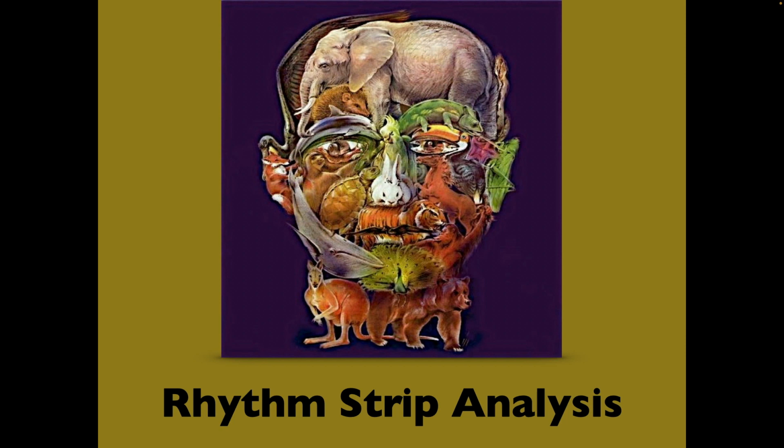And then, Anne, what about the S wave? How would you describe the S wave? Negative. Correct, and where is it relative to the R wave? The S wave, if it's there, is the negative deflection after the R wave. Now, one of the peculiarities is, although we always call it the QRS complex, there doesn't have to be a Q wave, an R wave, or an S wave. There has to be something, so one of those has to be there, but it could be the R, it could be the S, whatever.